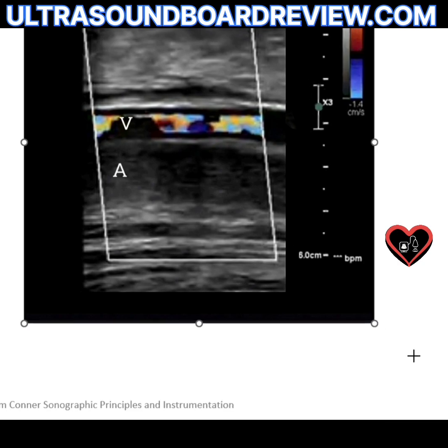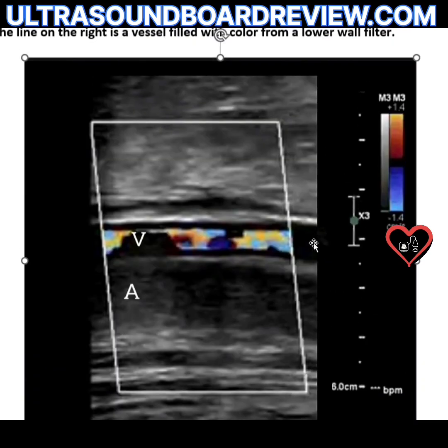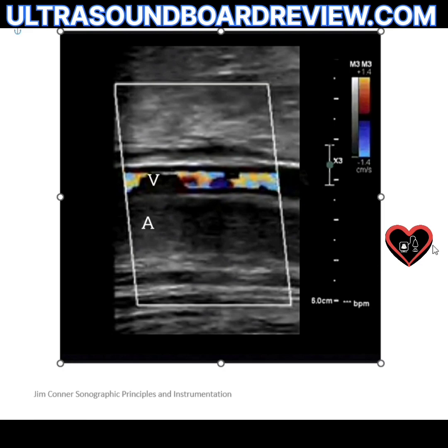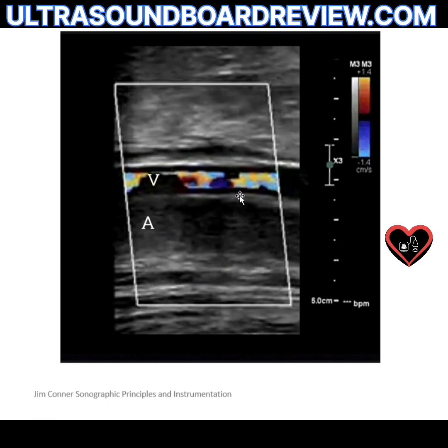Consider a scenario where a picture shows two vessels — one on top, one on bottom — with a color box. There's no color Doppler in the artery, and it looks like there's aliasing in the vein.